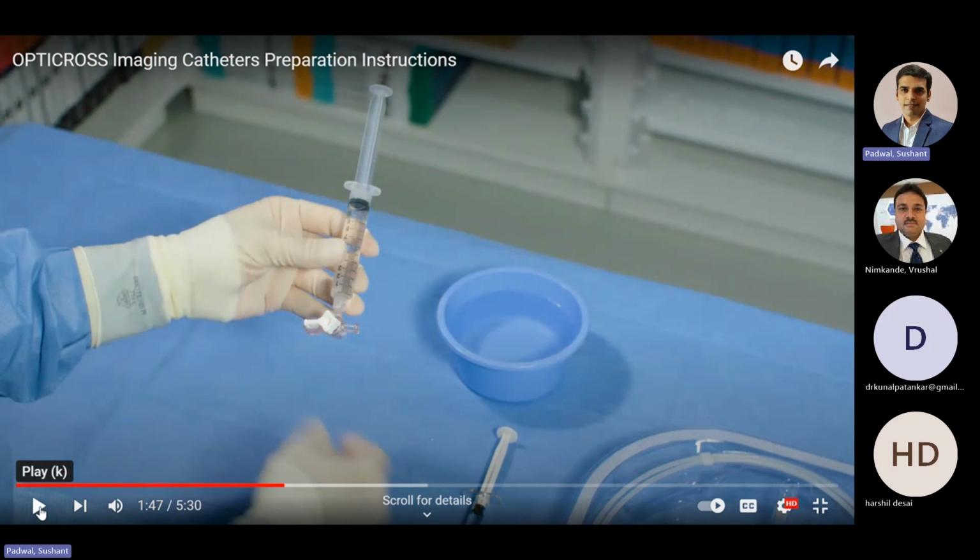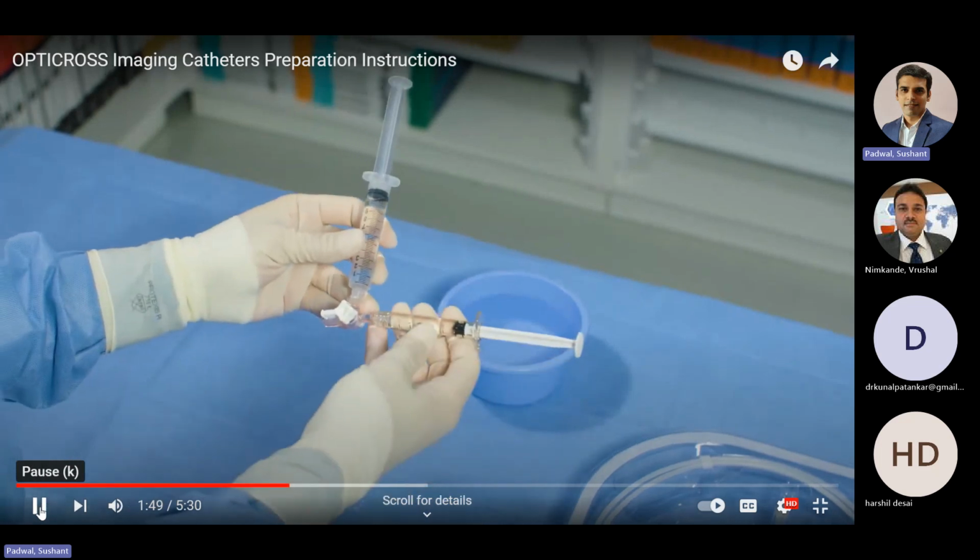So this step is also very important. It is similar to what operators do when they are preparing the balloon to connect it with the inflation device. They usually put some contrast inside, then put some droplets and then connect it, so that there is no air entrapment and it is completely air free, of the stopcock.